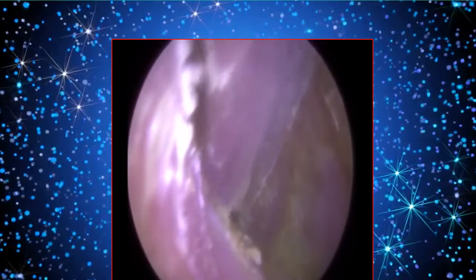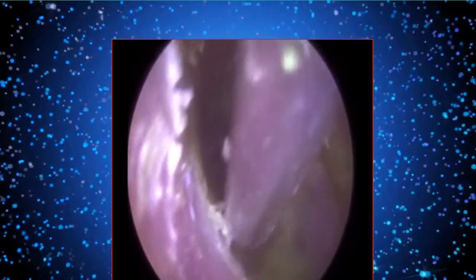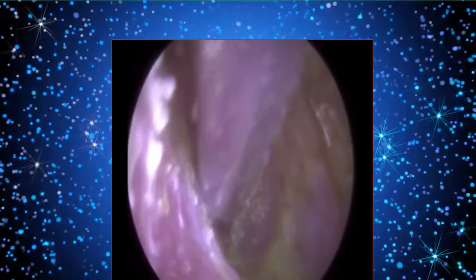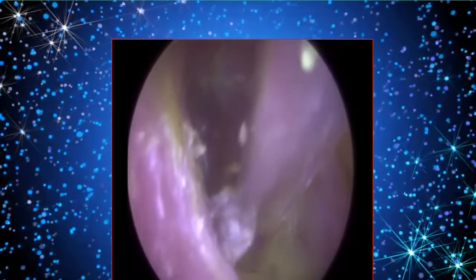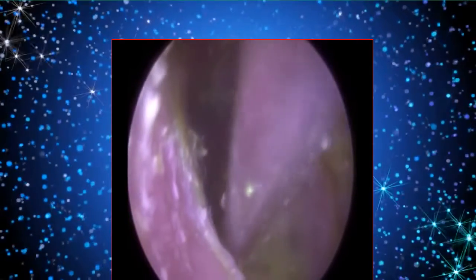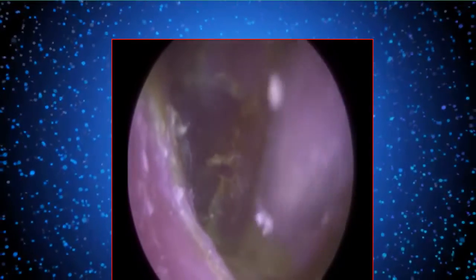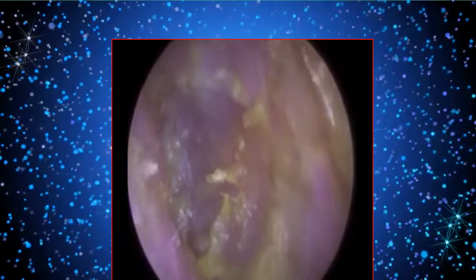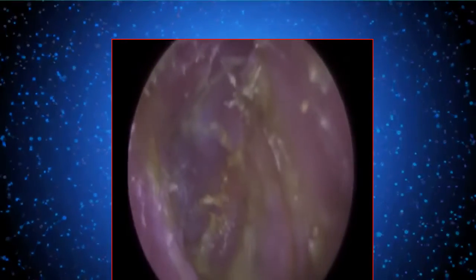So on the bony part, there's less swelling here, so we do have to be a bit more careful in this ear not to make contact with the left side, because it was a bit swollen, and that almost gives like a buffer effect. It provides us with some resistance if we do come in contact with the bony part. So just posteriorly, inferiorly, there's still a bit of dead skin and dead infected debris there, so we need to peel that off.